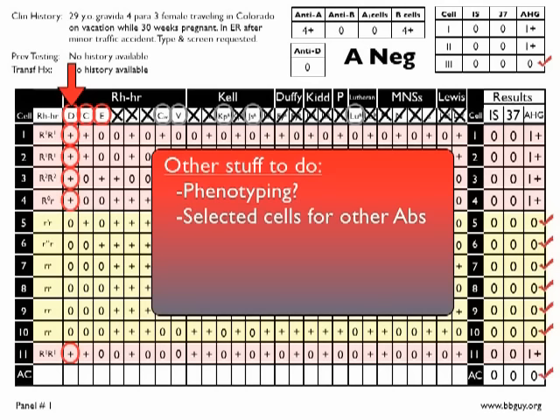You would also want to get some further history, because this, as I mentioned, the 30 weeks pregnant is an important historical fact. Most pregnant Rh negative females in the United States at on or about 28 weeks gestation will get a shot of Rh immune globulin. Okay, guess what Rh immune globulin is? It's anti-D. It can give you this exact picture that we're seeing, a fairly weak anti-D that may not have any clinical significance at all, but without knowing that history, you can suppose it's probably RHIG, but you don't necessarily know. And as part of that workup, that may include doing a titer of anti-D. Certainly if it's real, actual anti-D, you would want to do a titer and help the OBs follow the patient.